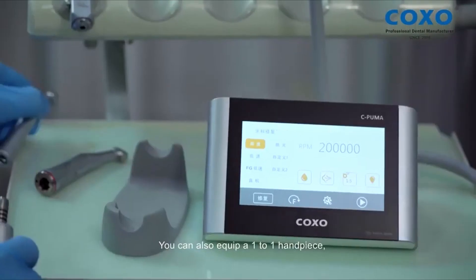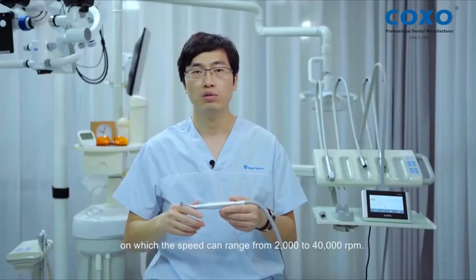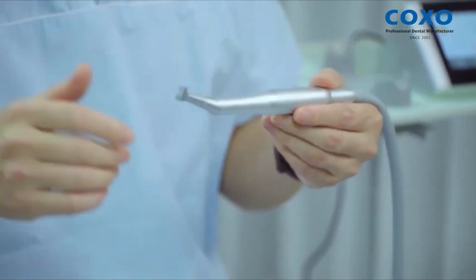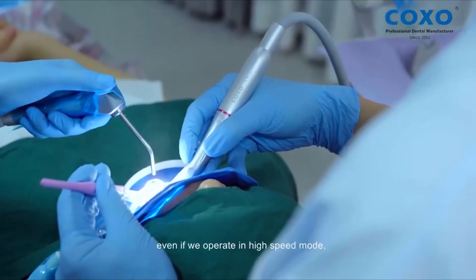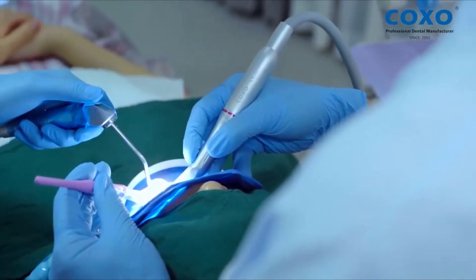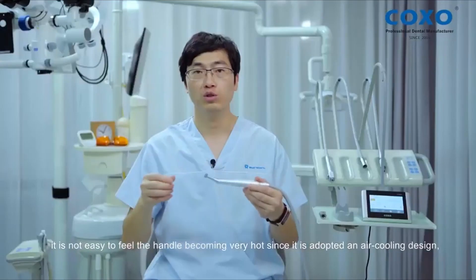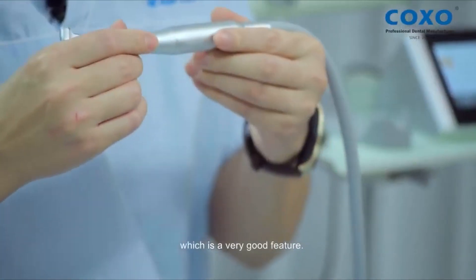You can also equip a one-to-one handpiece, on which the speed can range from 2,000 to 40,000 RPM. The motor's cooling design is quite good. Even if we operate in high-speed mode, it is not easy to feel the handle becoming very hot since it is adopted with an air cooling design, which is a very good feature.